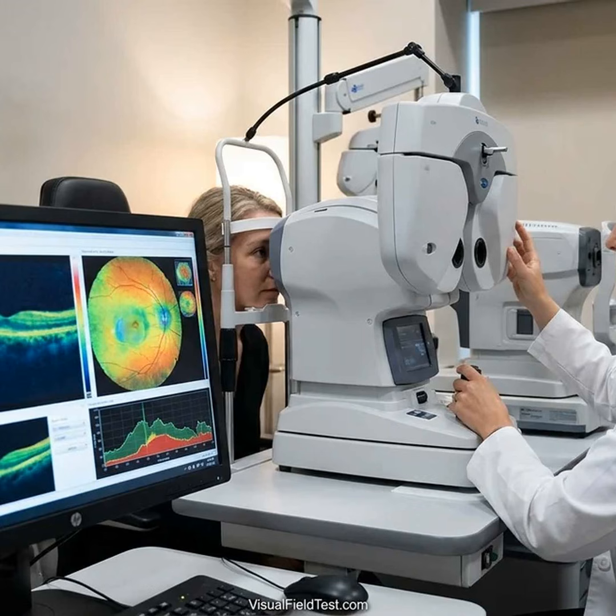Cataracts or media opacities. Any cloudiness in the eye, like cataracts or corneal opacities, can weaken the OCT signal. The result is a darker, grainier image and artificially thin-appearing retina layers. Doctors often check whether cataract surgery or additional dilation is needed if OCT results are borderline.